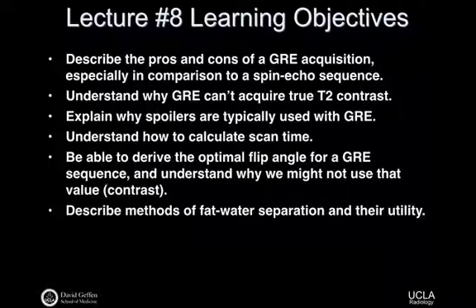And increasingly, what people are interested in doing is actually calculating fat fractions. What's the fraction of fat in a pixel? And that gives you information about the fraction of fat in the liver, right? And really diagnostic. I mean, this is really extraordinary. Put someone in the scanner, and if you can do the experiment under really carefully controlled conditions, you can say, sorry, but you have fatty liver disease, and that needs to be addressed.